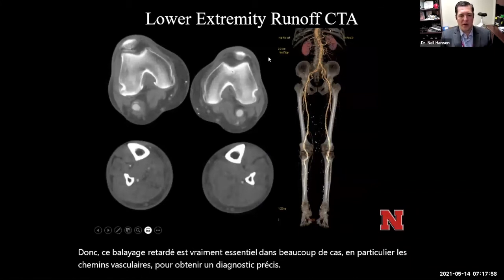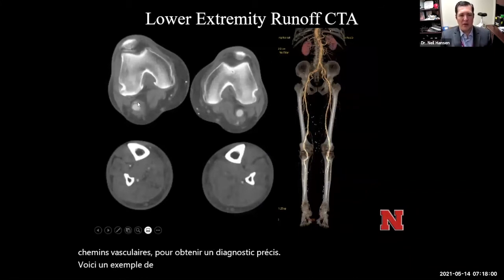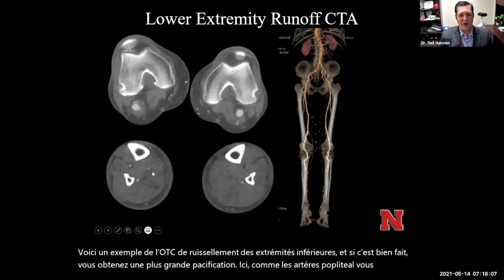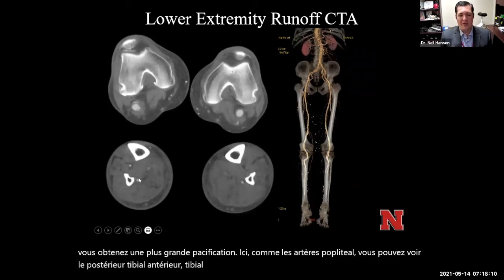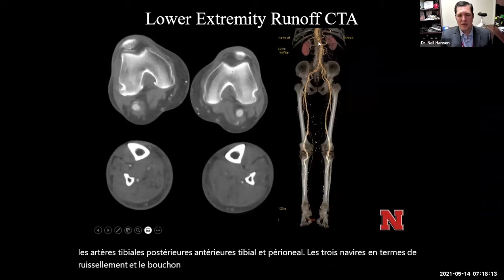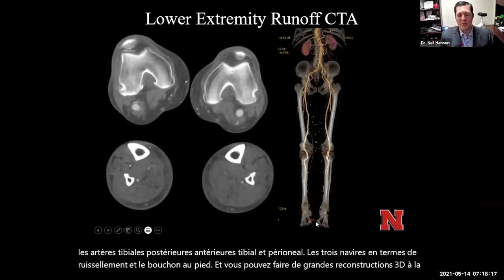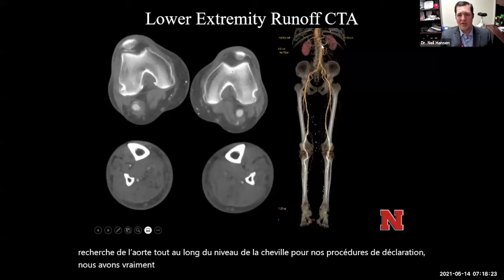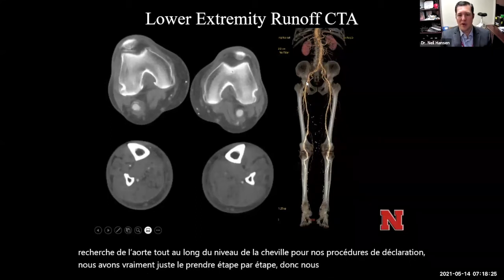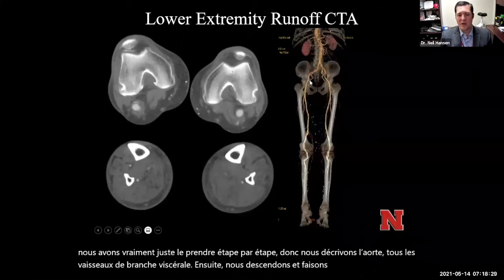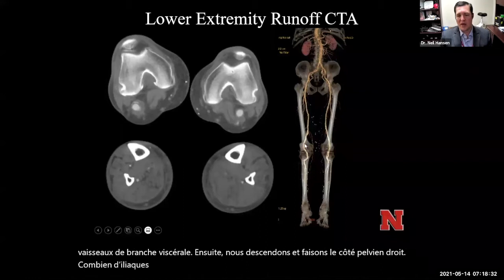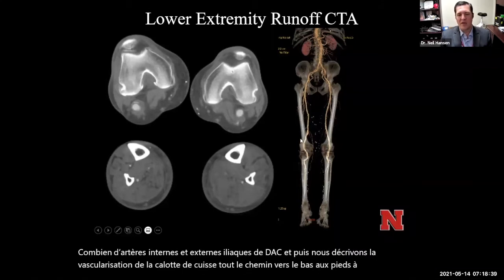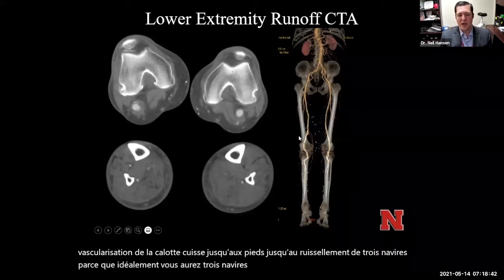Here's an example of a lower extremity runoff CTA. If done well, you get great opacification of the popliteal arteries, the anterior tibial, posterior tibial, and peroneal arteries — all three vessels in terms of runoff in the calf to the foot. You can make great 3D reconstructions from the aorta all the way down through the level of the ankle. For reporting, we take it step by step: describe the aorta, all the visceral branch vessels, then the right pelvic side — common iliac, internal and external iliac arteries — and then the vasculature of the thigh, calf, all the way down to three-vessel runoff at the feet.